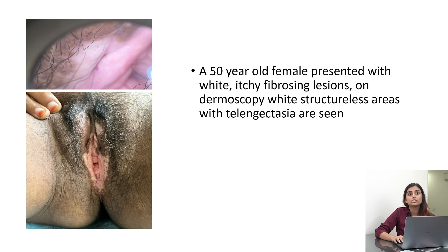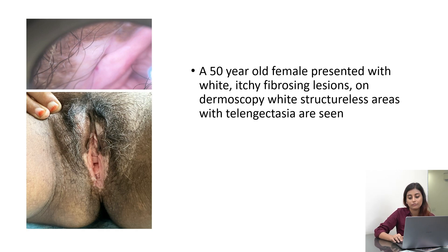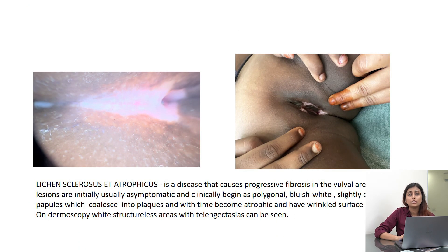Another patient — this was a female presenting with a fibrosing lesion — but on dermoscopy we see structure-less areas along with telangiectasia. You can see there is one dotted vessel and one vascular structure; because of a fold we are not able to fully appreciate it. So it is not diffusely white — not a clear white lesion — but we have a background of erythema, indicating lichen sclerosis et atrophicus.